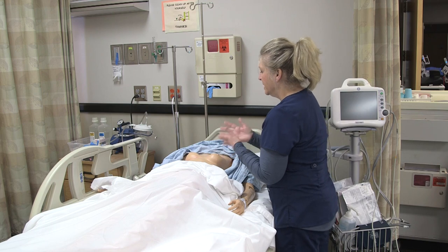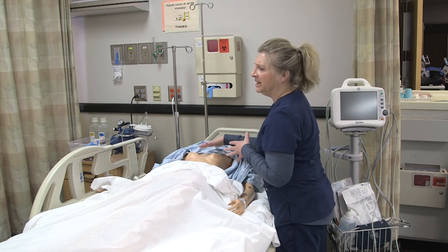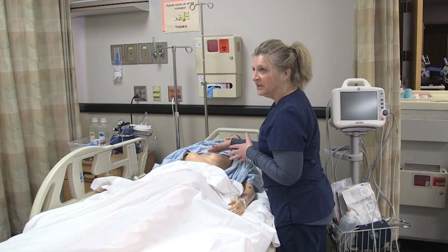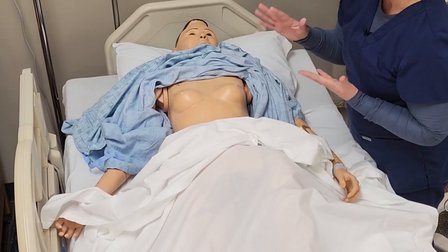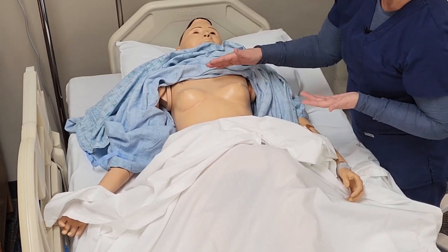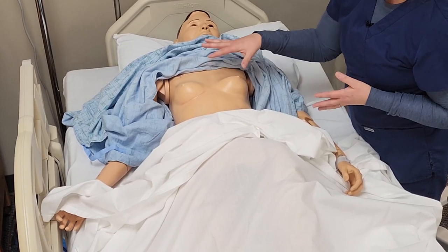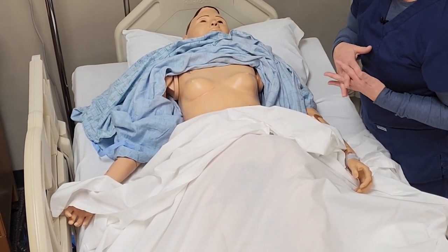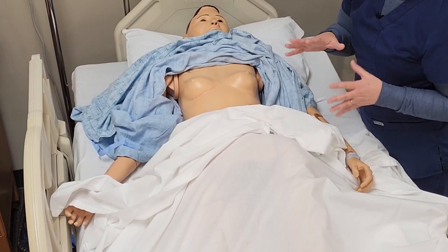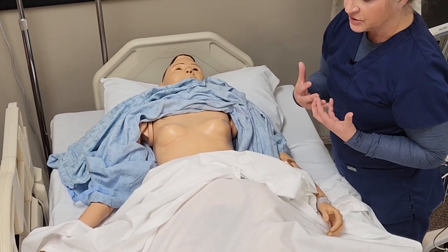Look at the chest wall and notice if there's any moisture that you need to remove with either soap and water — make sure you dry it well — or if there's some areas where you may need to use an alcohol pad to prepare it. Also, if it's a patient that has hair on the chest, you would want to clip that or avoid those really hairy areas, because you want to have good electrical conduction.